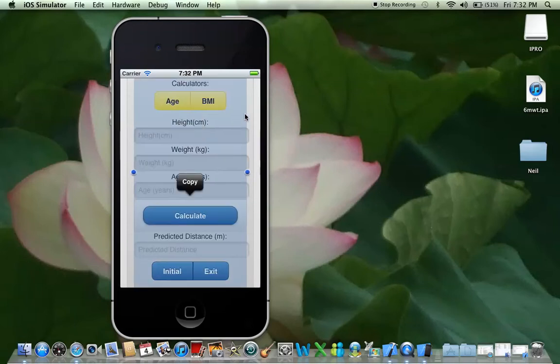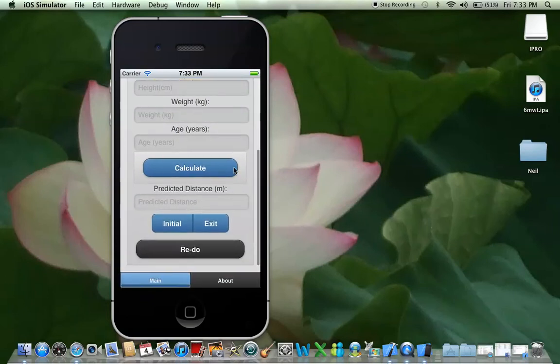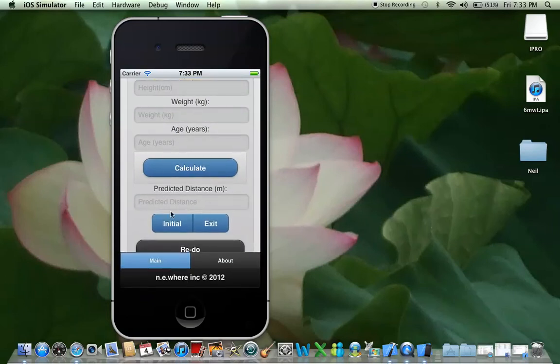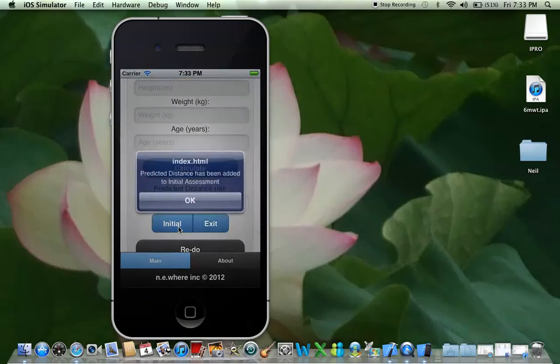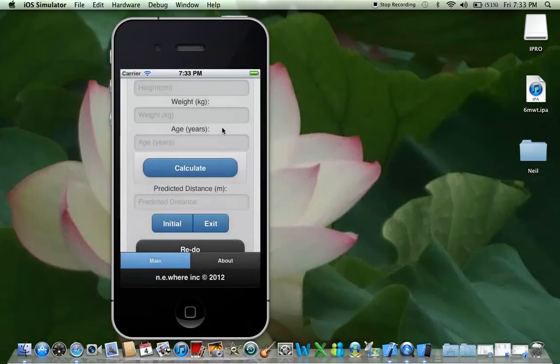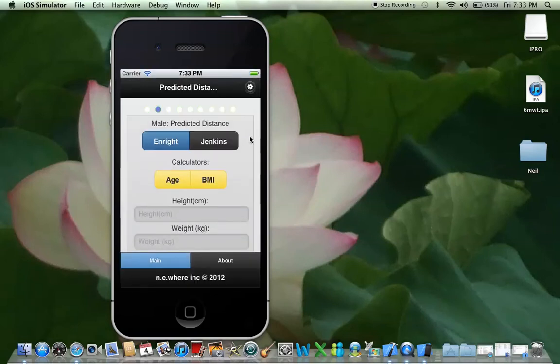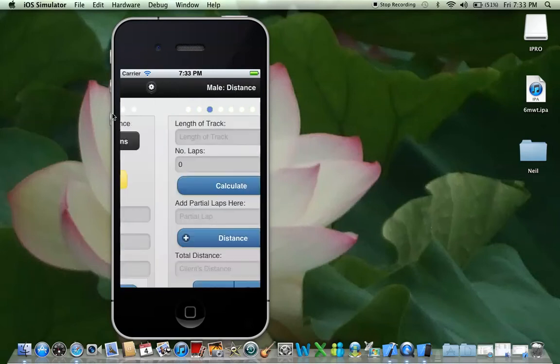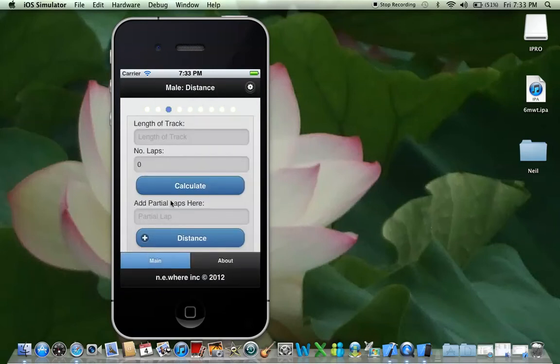Once you get the full answer of the predicted distance, you would transfer this to the initial assessment. Let's swipe onto the next page. This is where we do our client distance calculation — we've done the vital signs, we've done the predicted distance, and now this is the client distance.